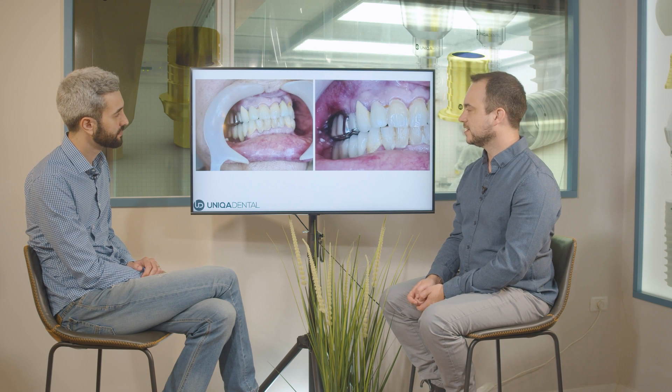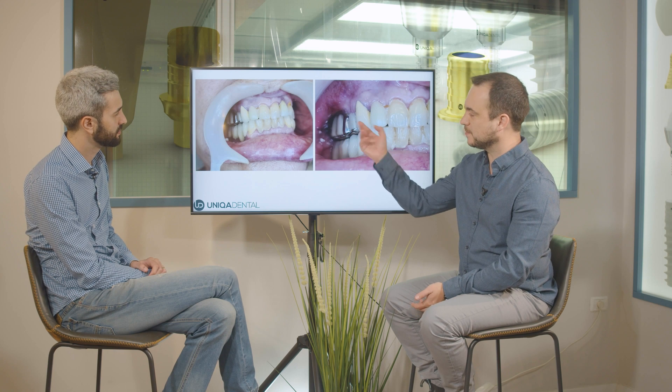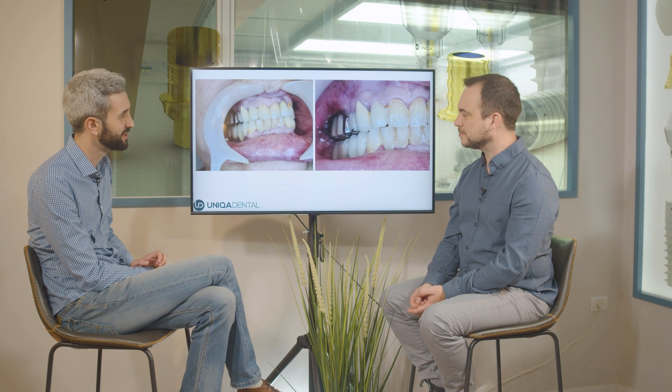The bridge has in the buccal part a little bit of ceramics, and some part of the ceramics broke — it's broken and a little bit worn off. This bridge was made a long time ago. And this is what's left from the teeth — not much, as you can see.